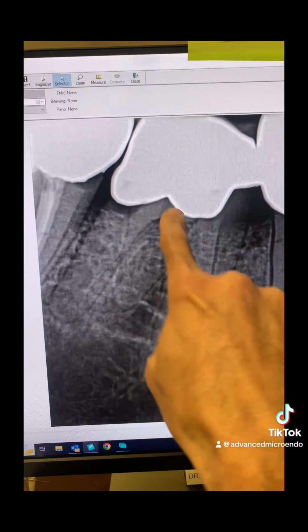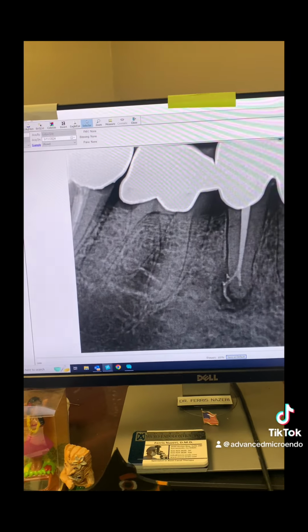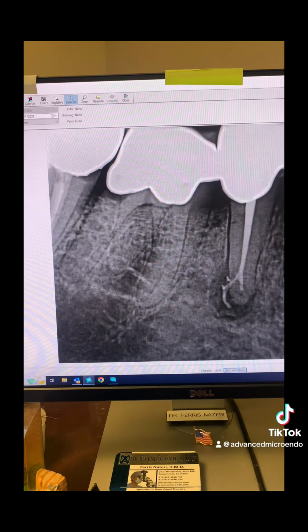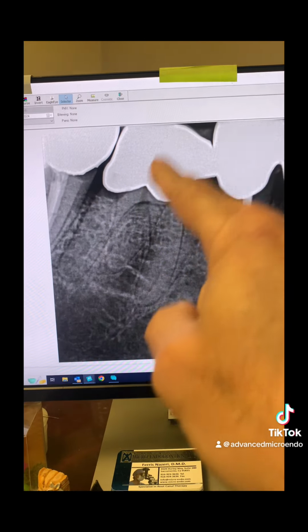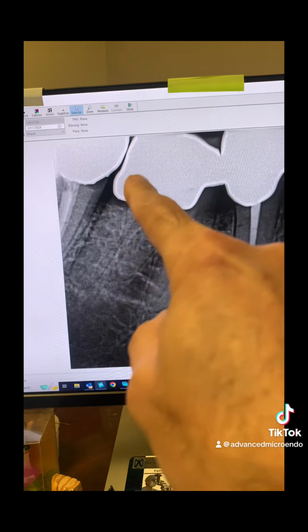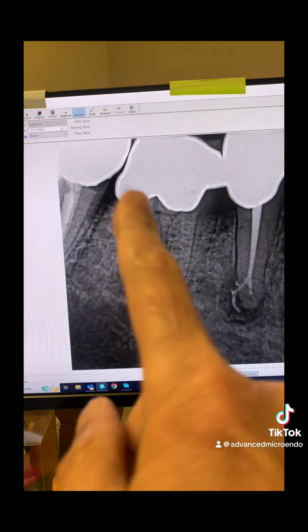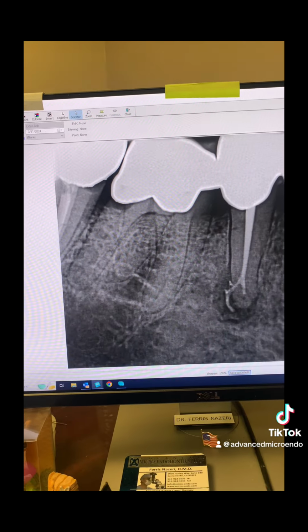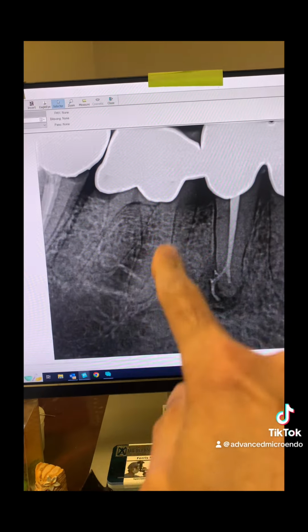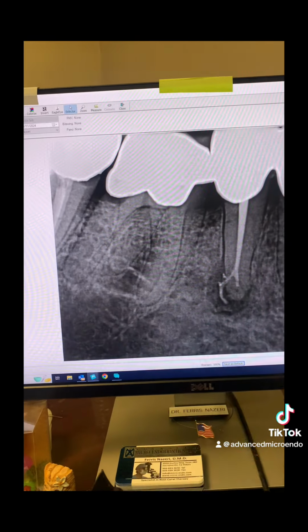And take a look. What kind of anatomy is this? Put it in the comments. So, of course, we needed to go ahead and do the root canal for him. Went through the PFM crown, removed the decay here, rebuilt that wall temporarily. He's going to need crown lengthening there, and a buildup and a crown, of course. But again, put it in the comments what kind of root canal anatomy or root anatomy this tooth has.